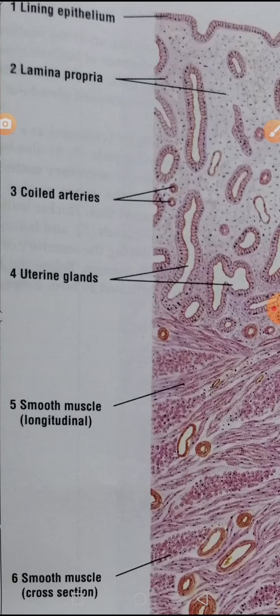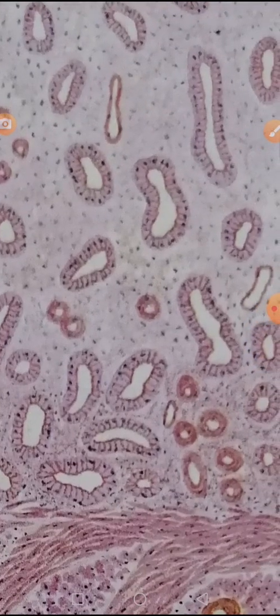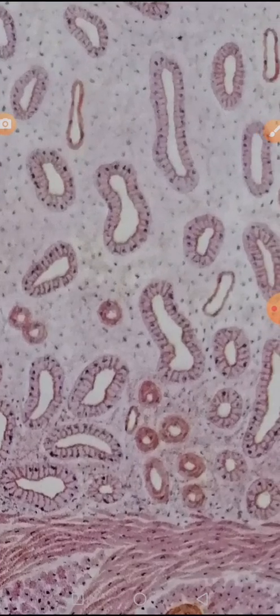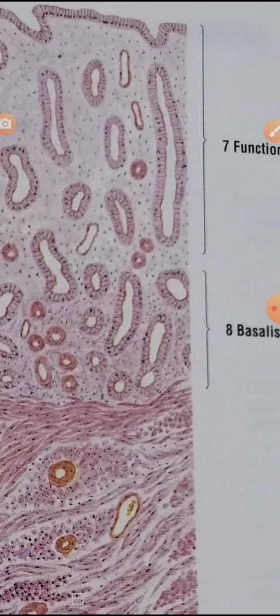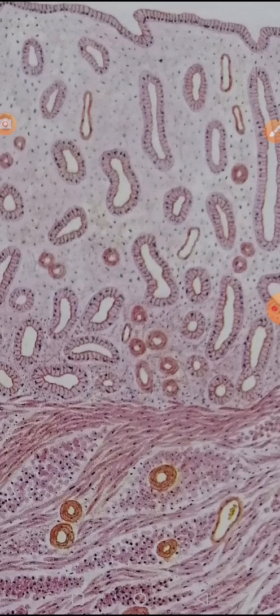which is the stroma. And in the lamina propria you can see these dots, and they're made using basophilic pencils, and they're the fibroblasts. And you can also see the fibers made using the pencil representing acidophilia, the various fibers which include the collagen type 3 fibrils, etc. So you have to draw the fibroblasts, and you have to draw the representatives of the collagen type 3 fibrils, and obviously there are uterine glands because of the invaginations of the lining epithelium.